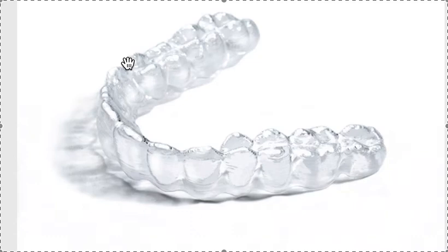So, posterior open bites are going to happen. Why? Well, because they're more rampant than they ever were because our patients are so stressed out right now that they're clenching on their plastic. They're clenching on their plastic at night. Not much we can do about that. You can do masseter Botox. That makes it go away. It's really, really helpful, but it's expensive.